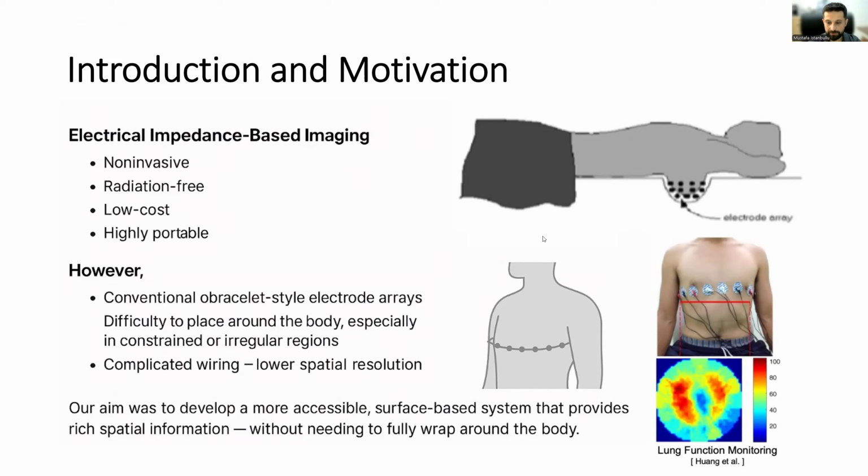They also involve complicated wiring and suffer from lower spatial resolution compared to imaging modalities like computed tomography or magnetic resonance imaging. Our aim was to develop a more accessible, surface-based system that provides rich spatial information without needing to fully wrap around the body.